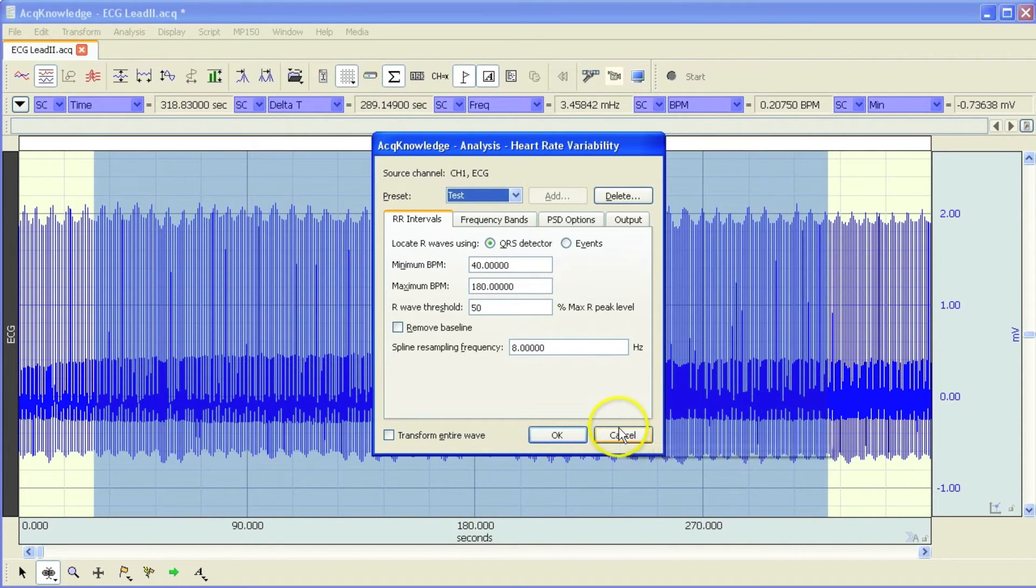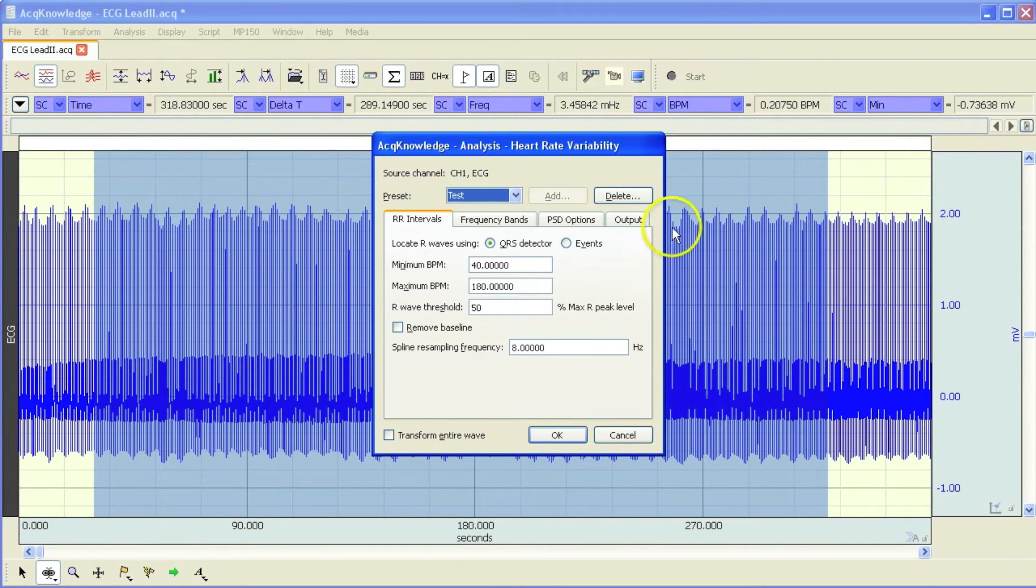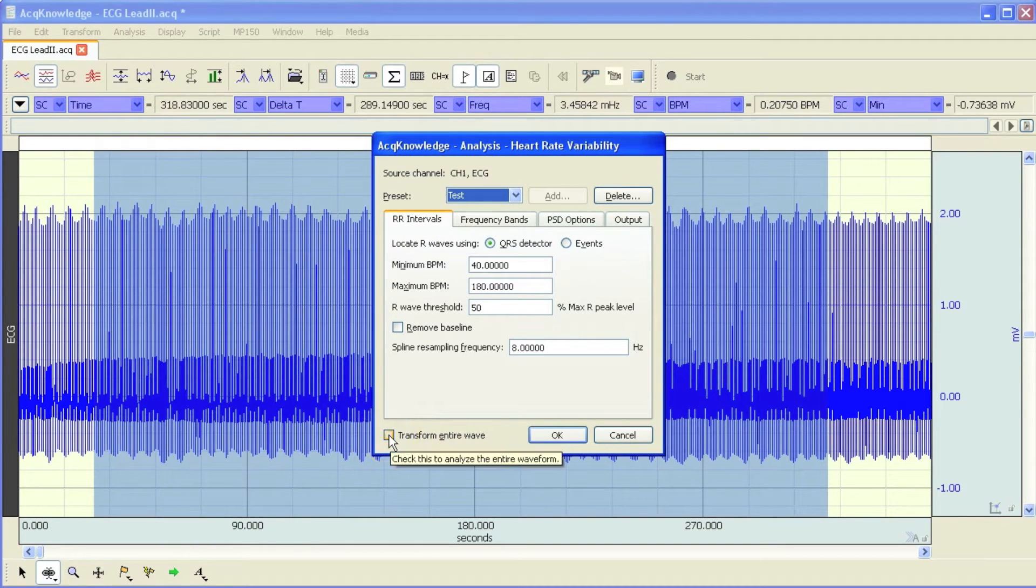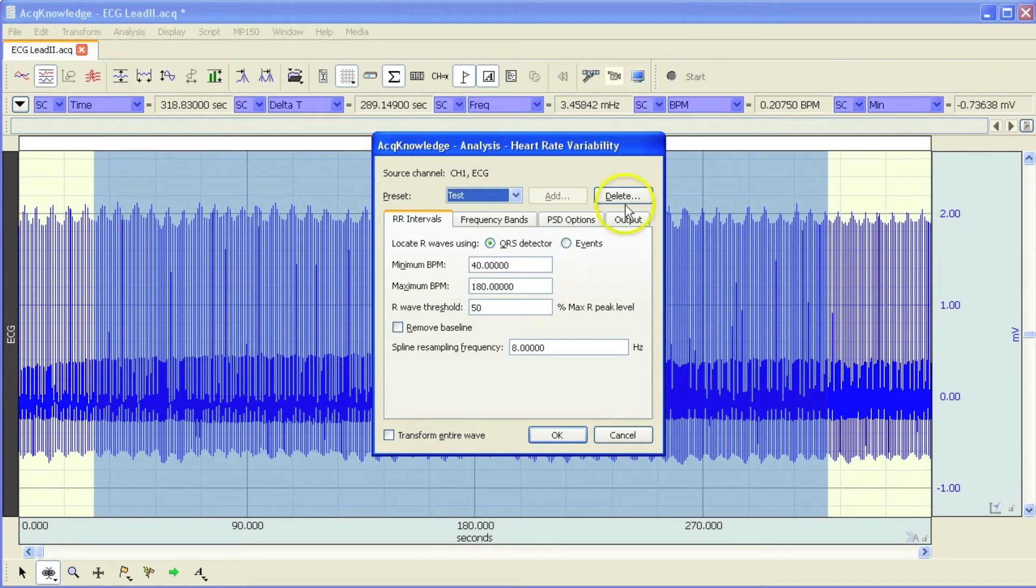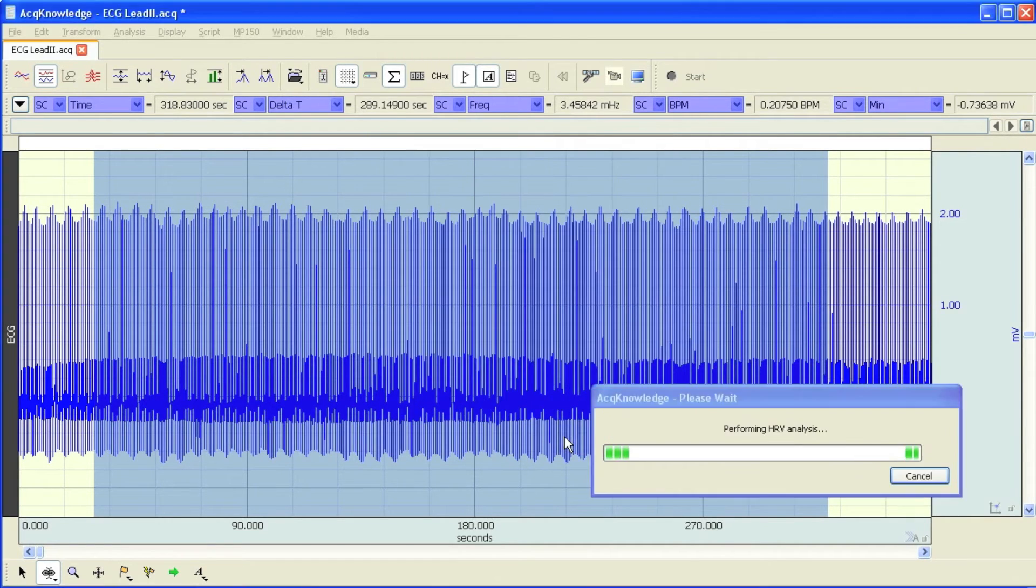I'll use the test one to use the QRS detector. But before I perform the analysis, I wanted to mention that there are two modes that you can operate within. In the background, you can see I've selected an area of data here, but we could just choose Transform Entire Wave and then the software will run the analysis over the entire file. But for this demonstration, I'm going to use this selected area. I hit OK.